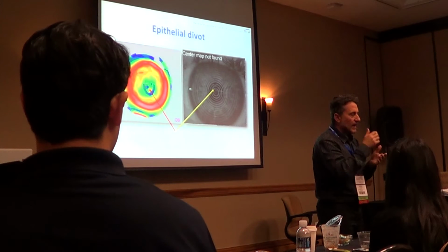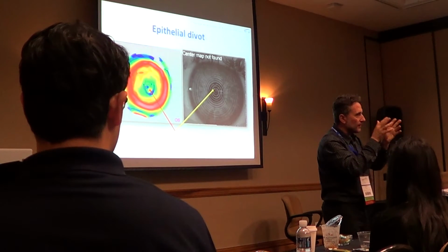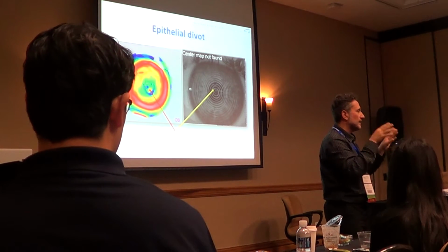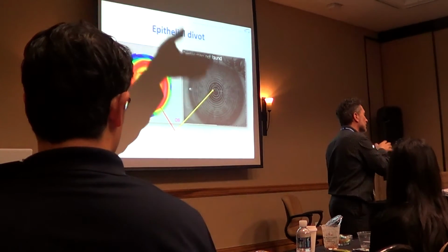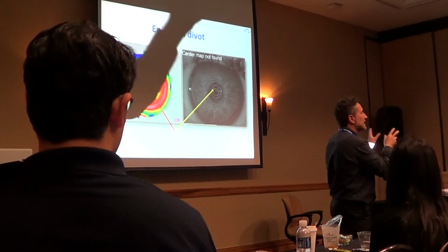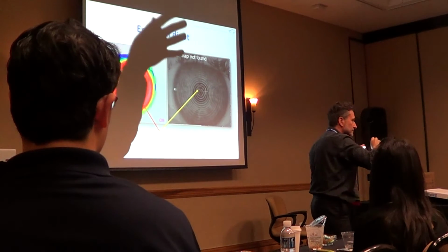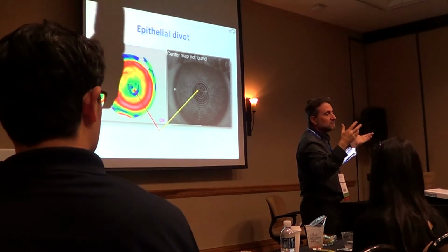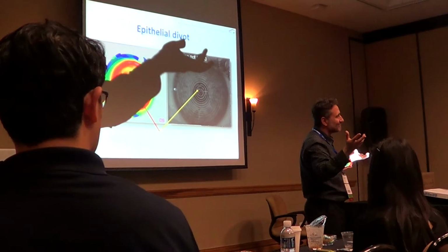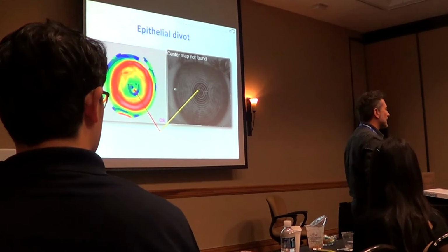Then I have a quick look, I wait, another look after 3 minutes, and I decide if this lens is right or not. I replace the lens or not. If I replace the lens, it's another one from the trial set, 1 step or 2 steps and so on. And after that, do the Ortho-k prayer. Exactly. And after that, yes, I order the final lens.